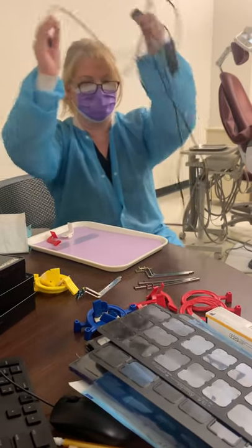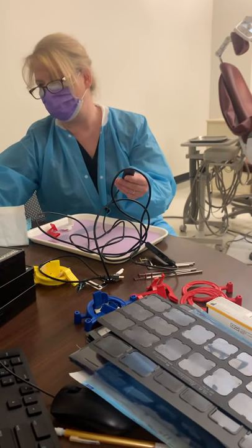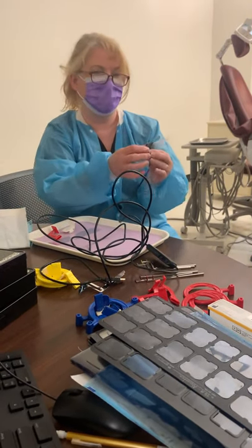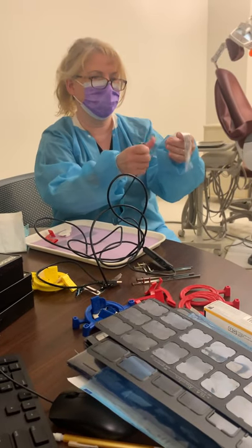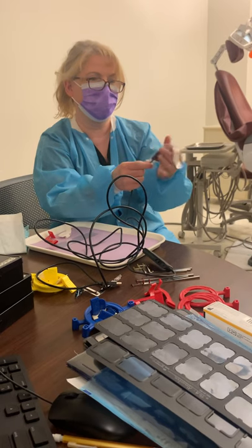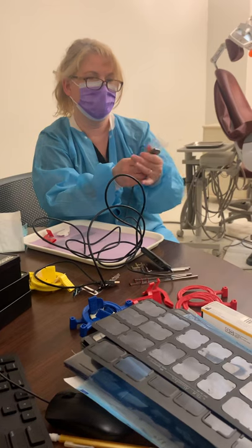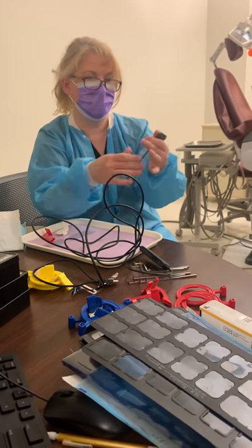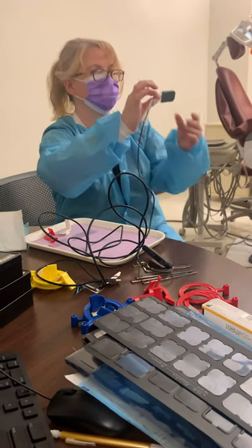You plug this end into the computer, and then for our barrier protection we have sleeves. This is a universal size — you put the barrier sleeve over the top of your sensor, pull it all the way down, and now it's ready. Now it can go in the patient's mouth.